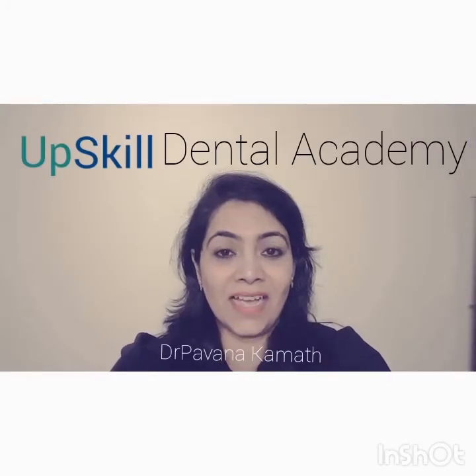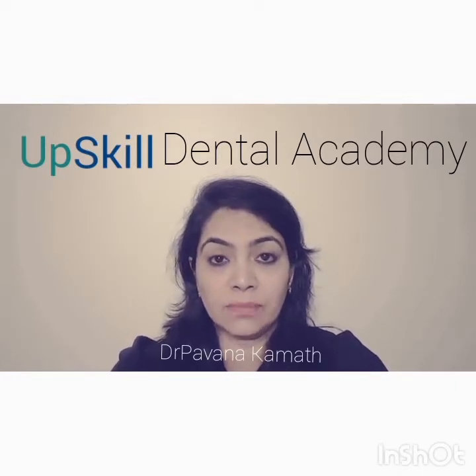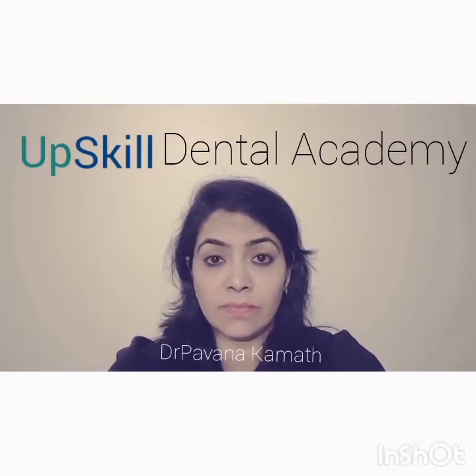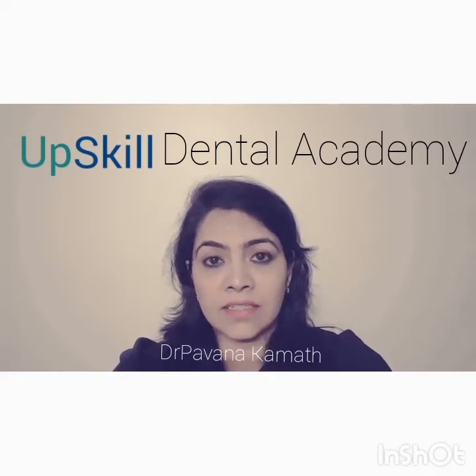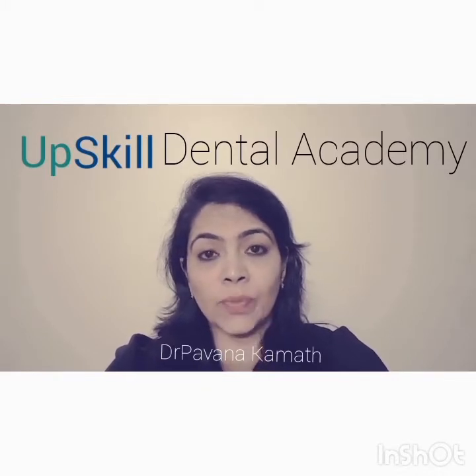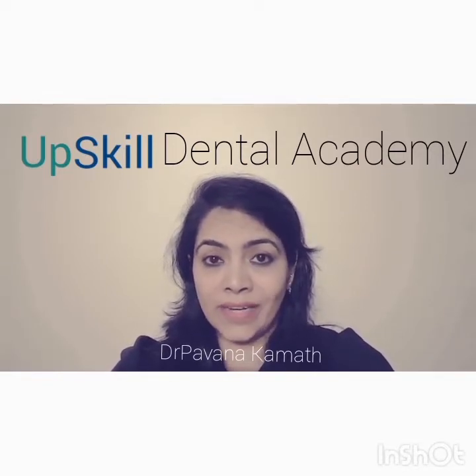Hello everyone. Today's presentation is on a procedure in root canal treatment — a small but vital step between the preparation, disinfection, and obturation: the drying of root canals. I'm often asked how to dry the root canals, how much to dry them, and how we know they are dry and ready for obturation. I hope this video answers all your queries.